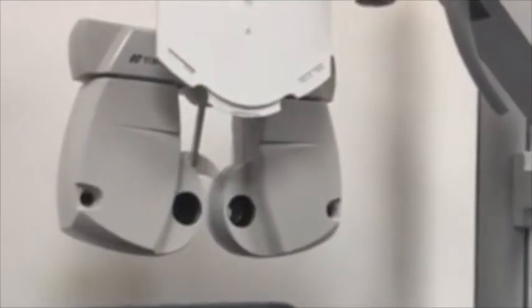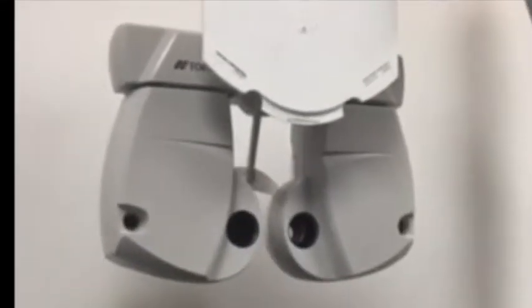I'm an optometrist and just wanted to explain a little bit about what I do during the eye exam and show you some pictures of the back of the eye. One part of the equipment that I use is called a phoropter. We put different lenses in front of the patient to check the vision.